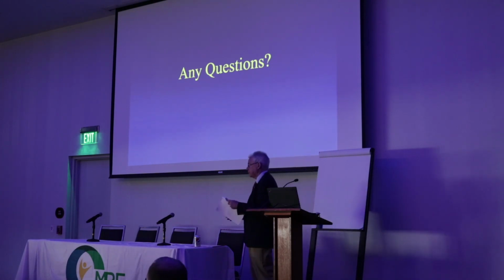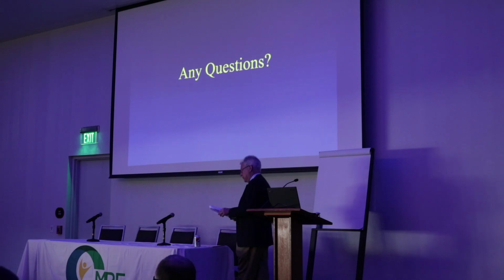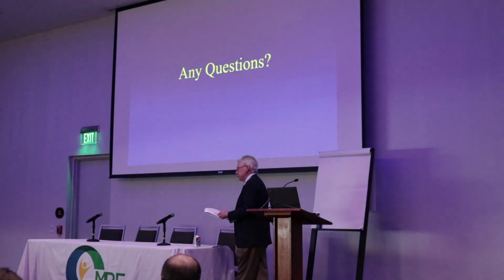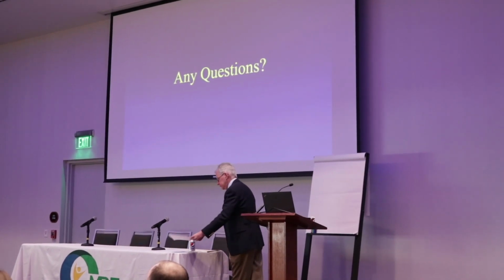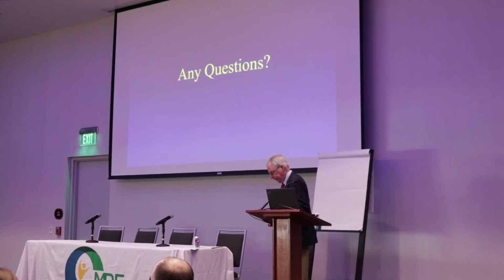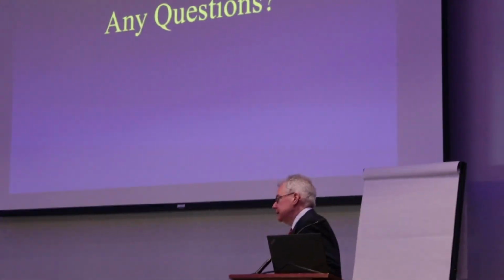Is there a way to know, or who would you ask if you're getting images, if you wanted to get an independent evaluation of whether you have a high quality MRI or not. You know, from an anecdotal, I know you said that there's variability. My brother-in-law's brother in South Dakota had some back work done, and he had an MRI there, and then he went to a specialist in Florida. He said he can't believe the difference in the MRI images between what he got in South Dakota and what he was getting from these guys that do it all the time in Florida. He said it was like night and day, like a high-res versus extremely low-res sort of thing. So how do you know if the images you're getting are of a quality that they should be to pick up the kind of metastases that you might be looking for?